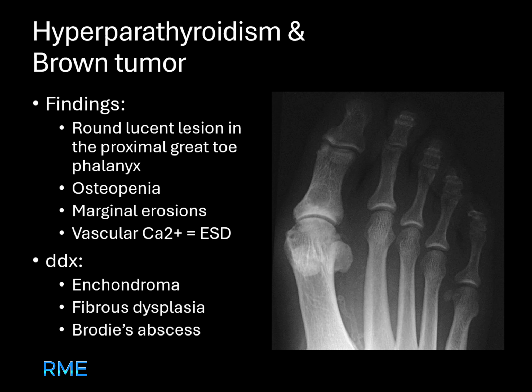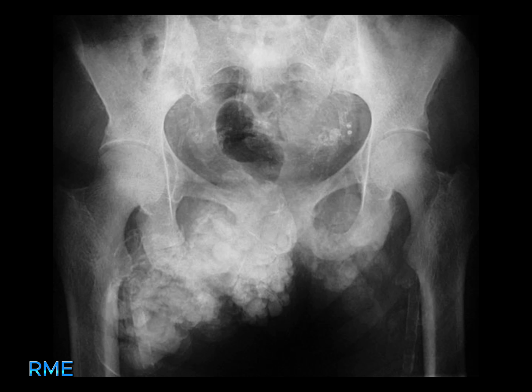To further evaluate, I would recommend a serum PTH level test to confirm hyperparathyroidism. Management involves treating the underlying hyperparathyroidism, which may include surgical removal of the parathyroid adenoma or hyperplasia. Let's move to the next case. What do you see in this image?